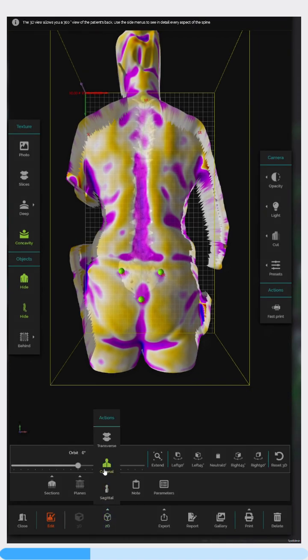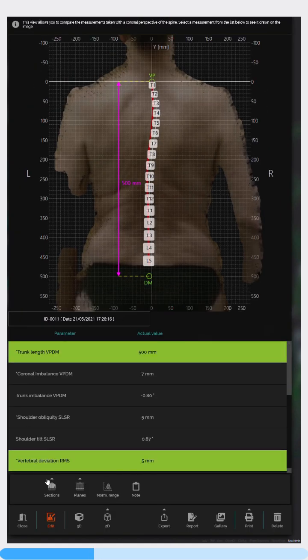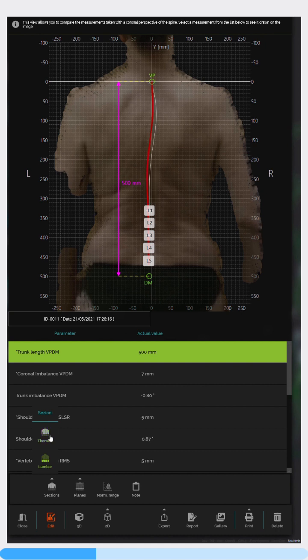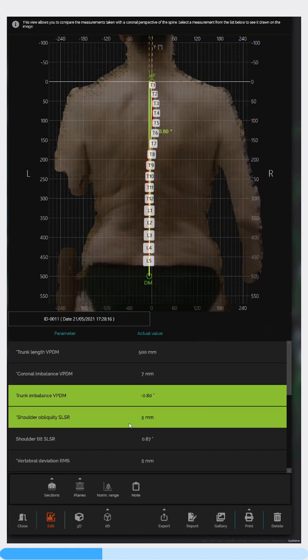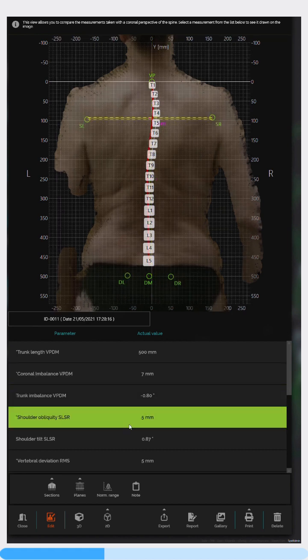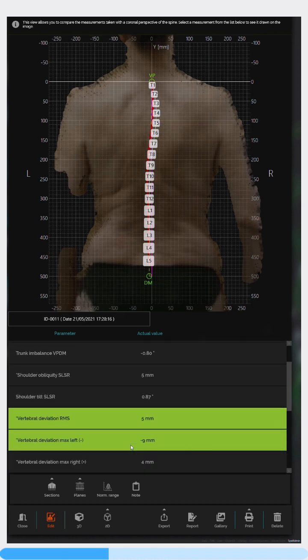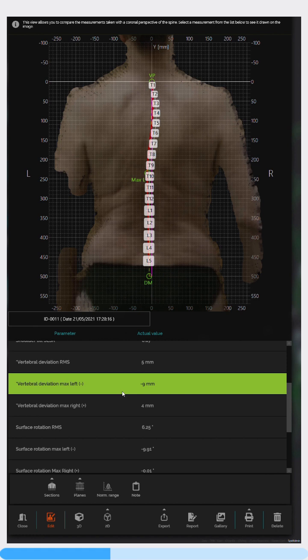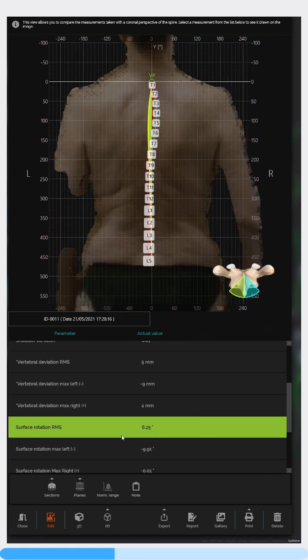And switch that to 2D models as we're doing now. So we're looking in the coronal plane, but we have all of that 3D data to hand. We can decide to take or remove the information that's relevant. So if we find that there's some data that's being hidden by the vertebral images on the screen, we can remove those points. This is quite relevant when we're looking at rotation. So this person who has mid-thoracic pain, we can remove the thoracic component and see the rotational component.